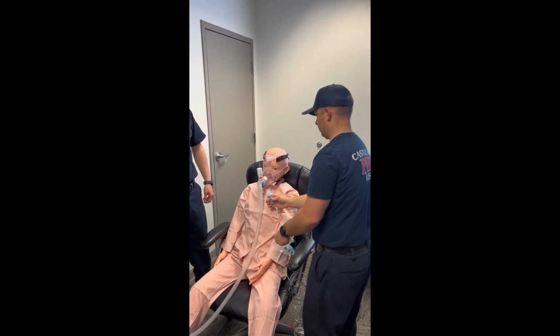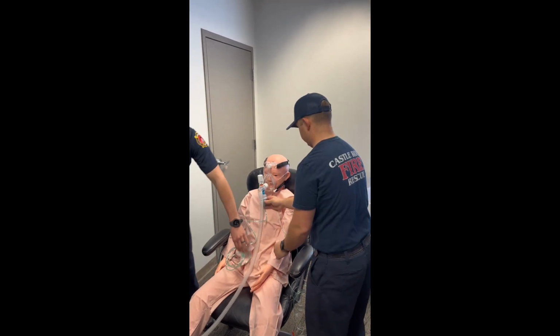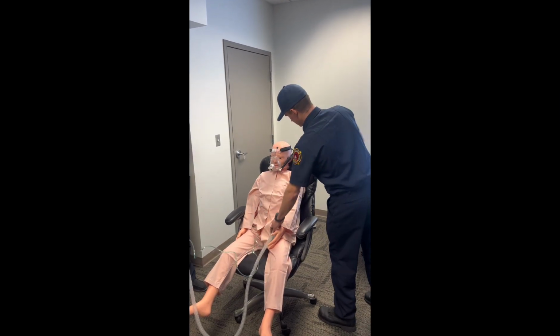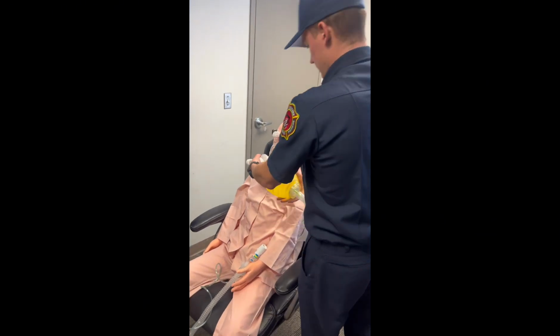Once the mask is fully in place, then we can apply the nebulizer. If your patient decompensates, there's no need to rip off the mask. Leave it in place, unplug the tubing, connect your BVM, and assist ventilations.